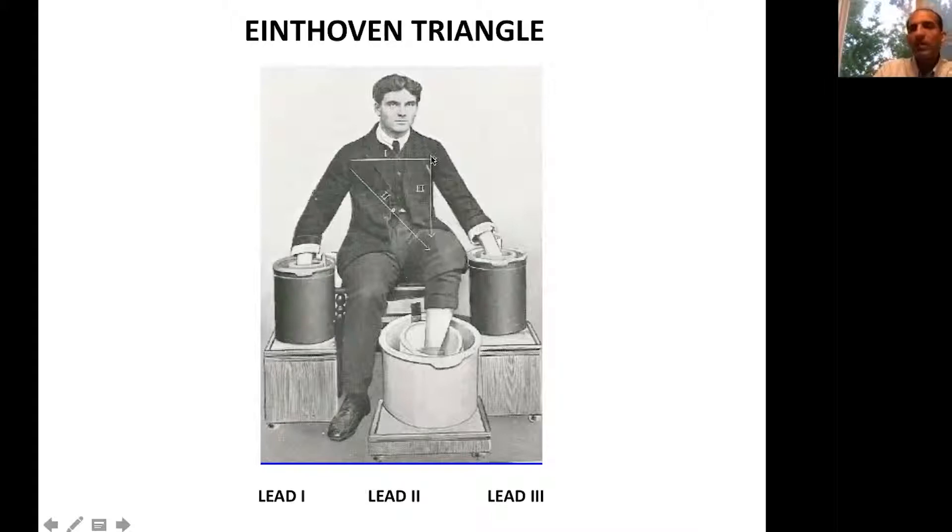The general rule is lead two equals one plus three. If you take one plus three, it becomes lead two. This is a basic fundamental principle that you should know. This is how basic ECG is started and done. Everything else is based on that. I always keep this image in my head about lead one, lead two, and lead three. Once I know that, I can derive everything I see on the ECG based on this.